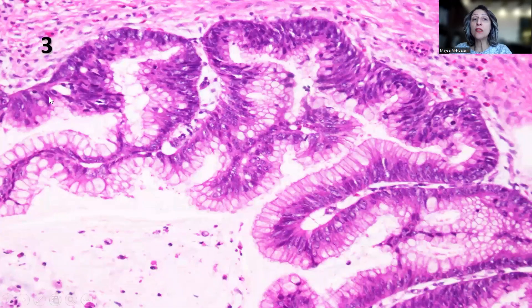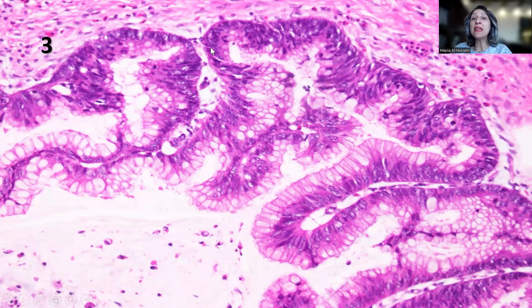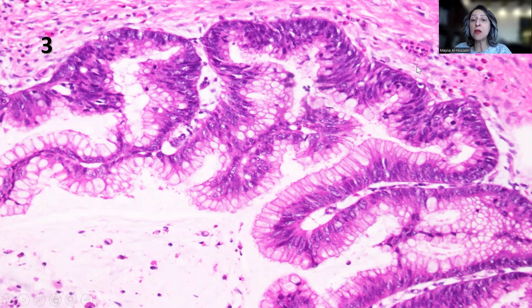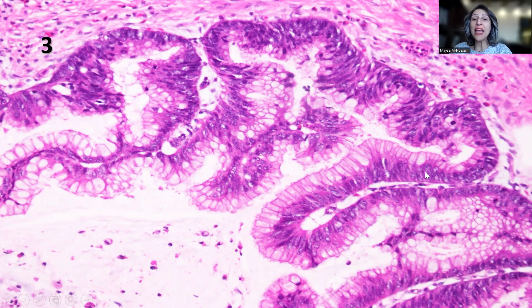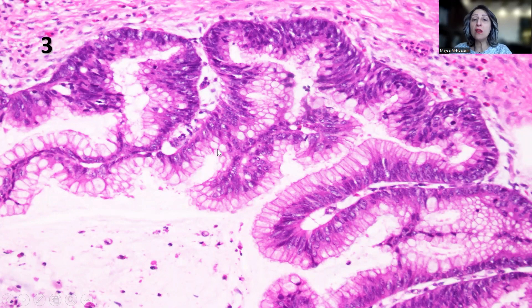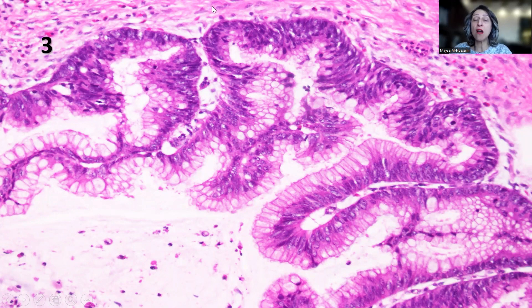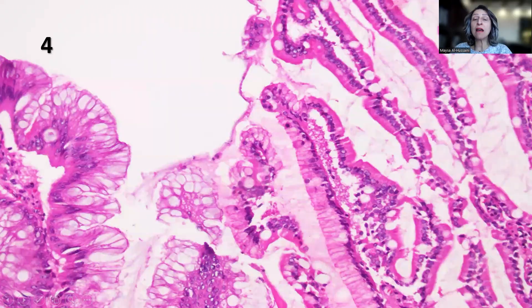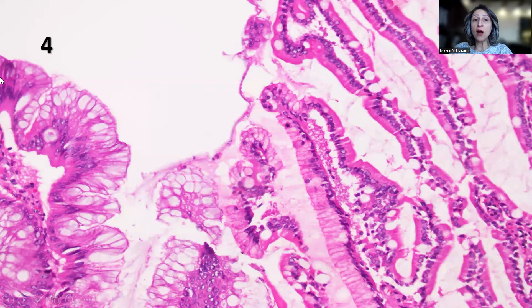This is number three — one of the main invaginations from the main pancreatic duct, showing again the exact same morphology with the villous transformation of the surface and high-grade dysplasia. This focus is from the ampulla of Vater.